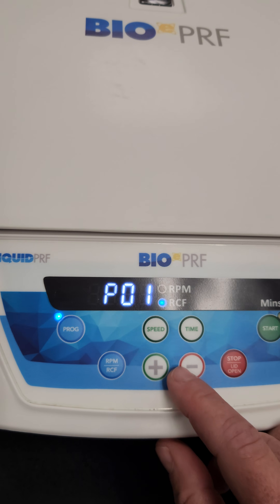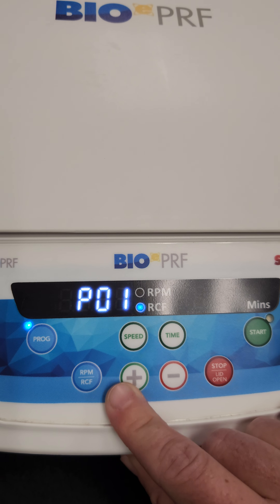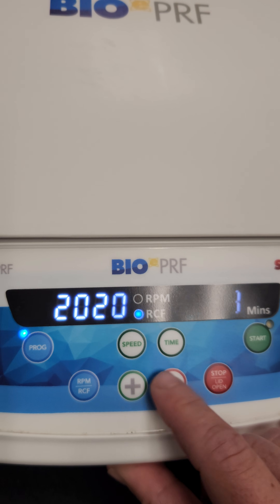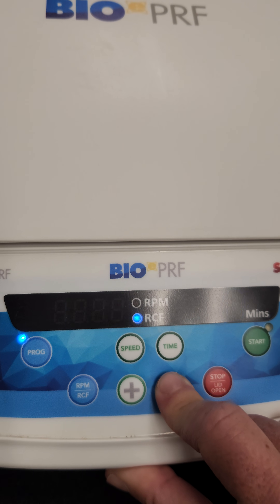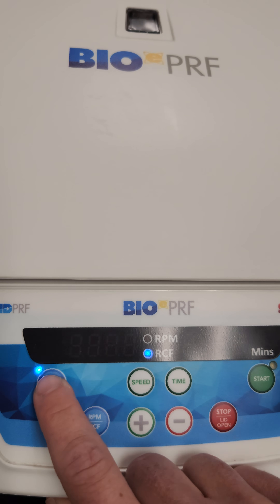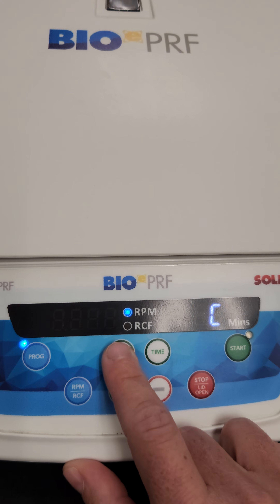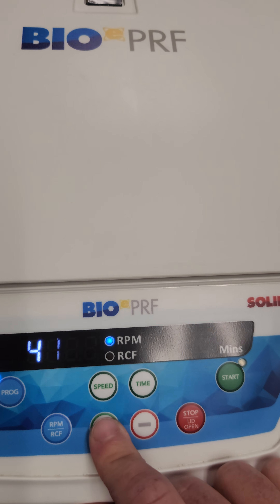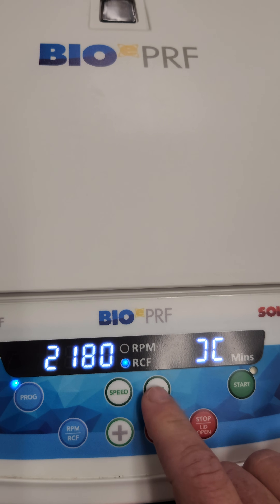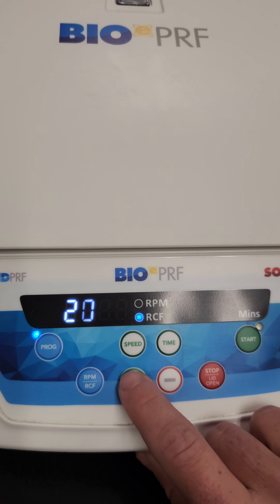You'll see program one, two, three, four available. Let's see what program one has — that's 2,000 for eight minutes. So let's say we want to change that to 700 for eight. Then for program two, let's change that down to 200 for eight minutes.